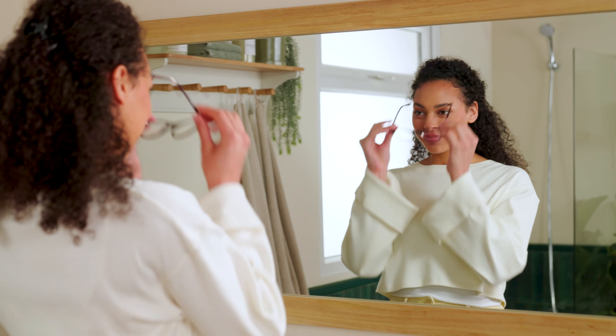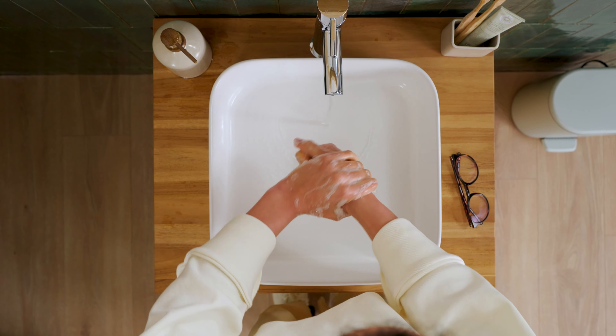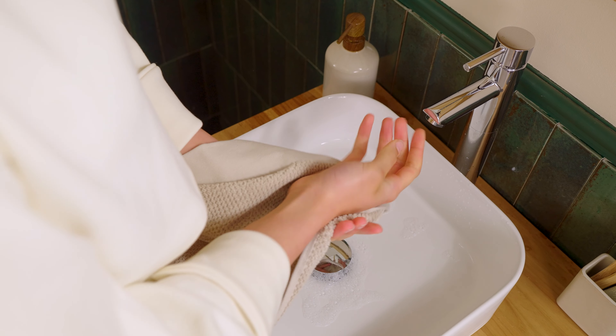Looking for some tips on how to put in contact lenses? Then you've come to the right place. First of all, make sure you wash and dry your hands. Perfect!